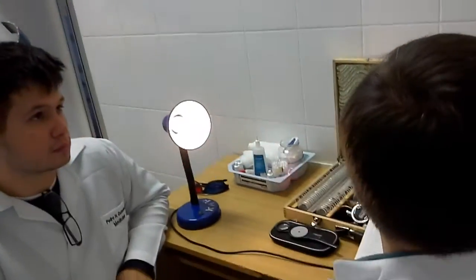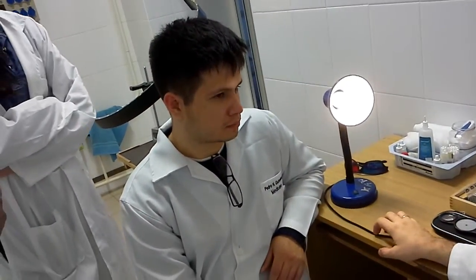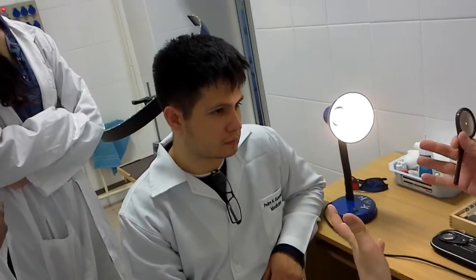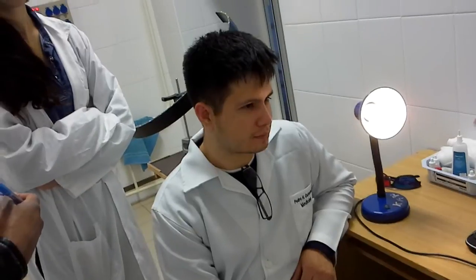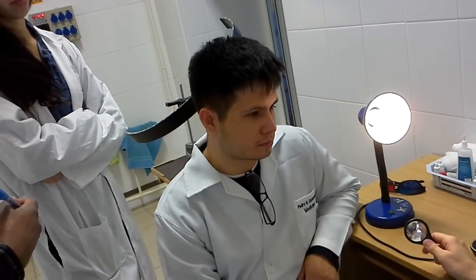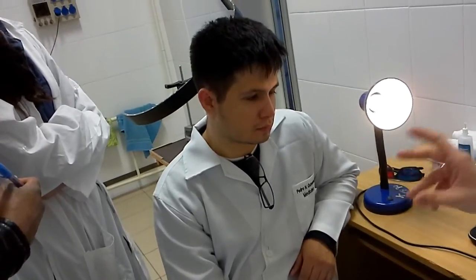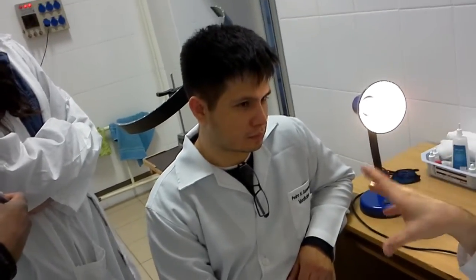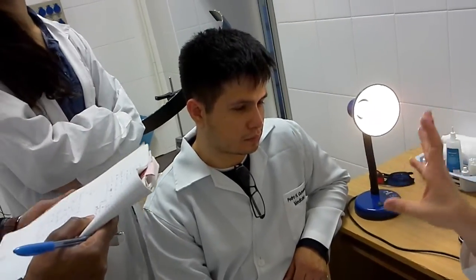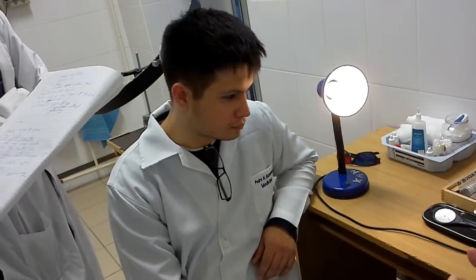If such real patients come, I'll bring them to you. But now you just simulate. Of course, he can see, but a real patient with very poor vision can't see, and can see only light and direction of light. Okay, if all the answers are correct, the conclusion should be that the patient has normal or correct light projection. If there is even one mistake, wrong light projection. So it was test number 13.